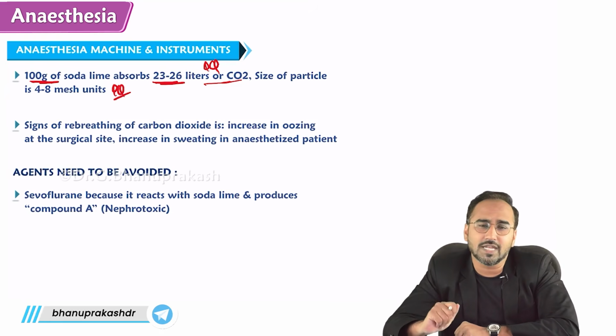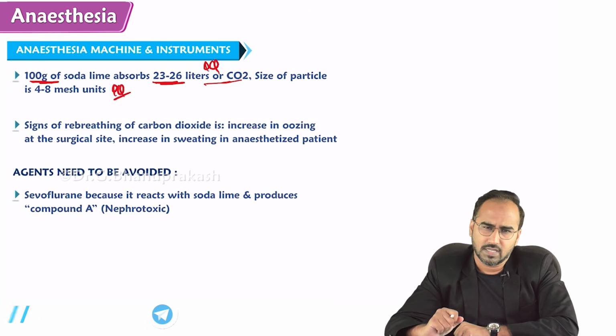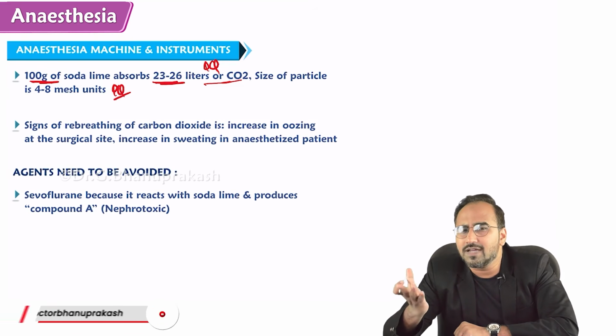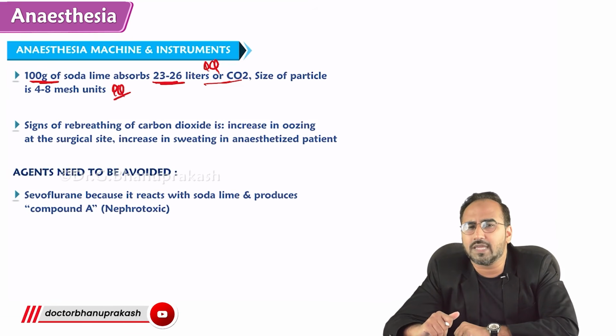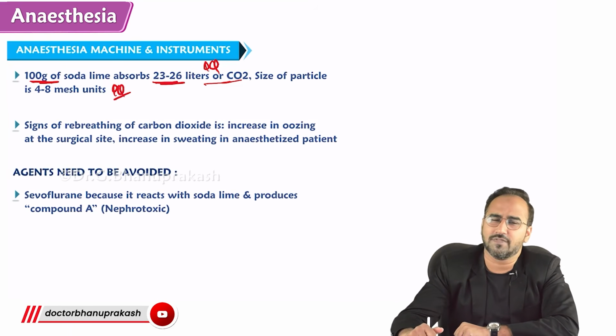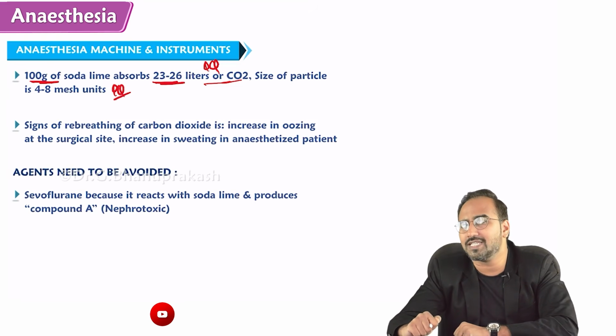If the patient re-inhales his own carbon dioxide, what will happen? If I re-inhale my own carbon dioxide, what will happen to me? My carbon dioxide level increases. I will develop hypercapnia. I will develop hypoxia. My oxygen saturation falls.